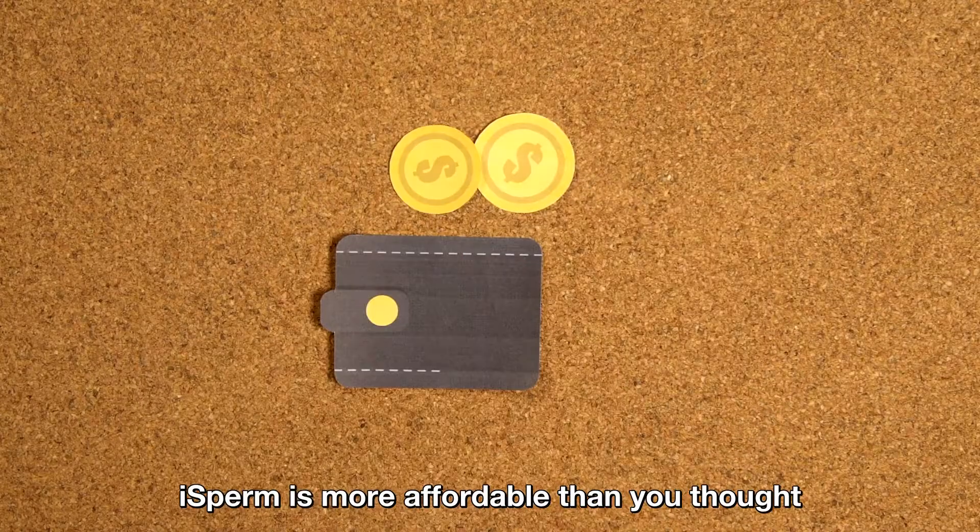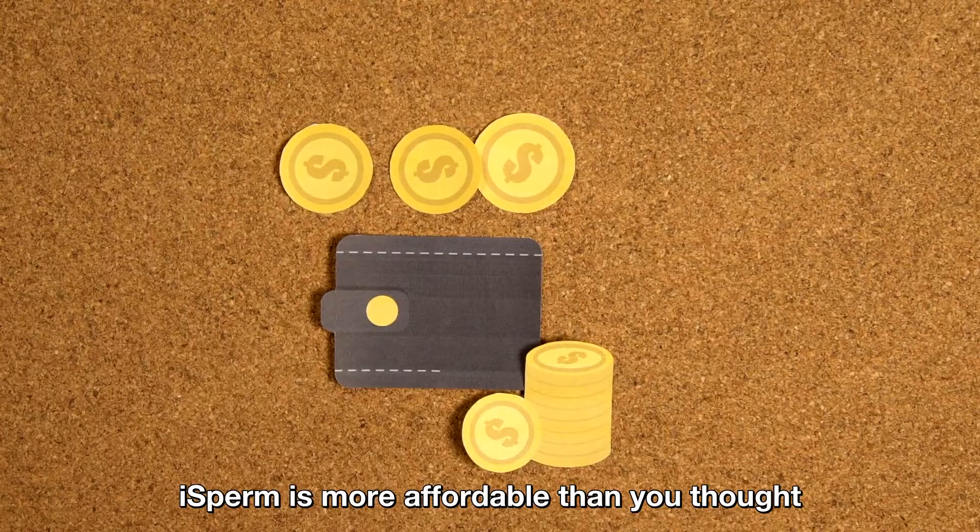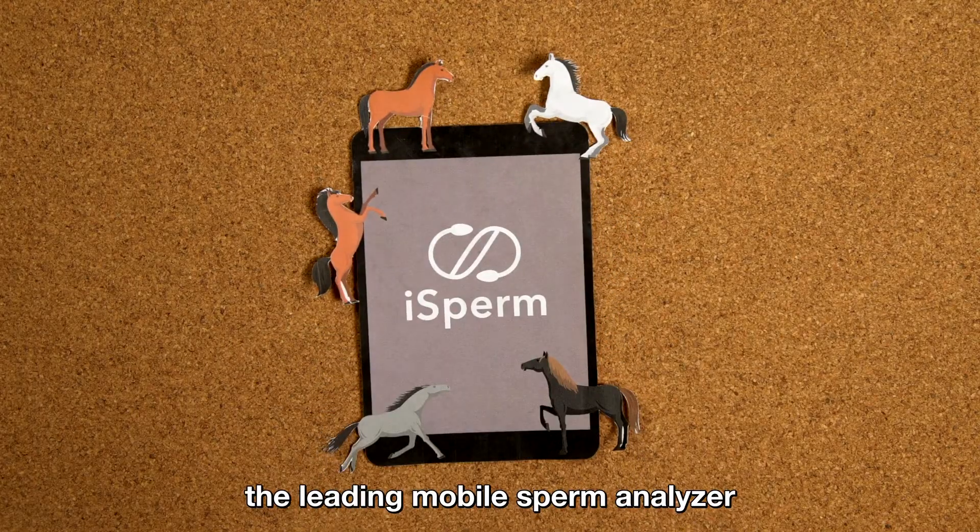On top of that, iSperm is more affordable than you thought. iSperm, the leading mobile sperm analyzer.